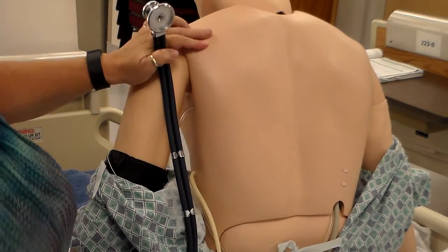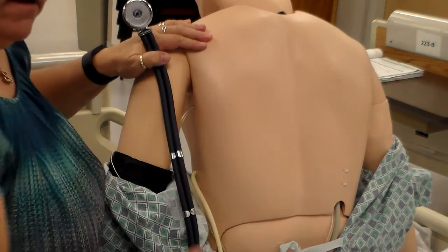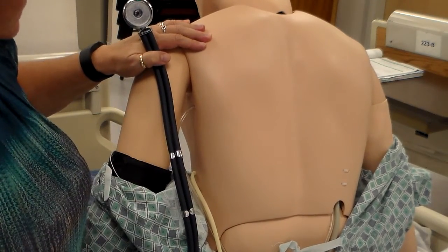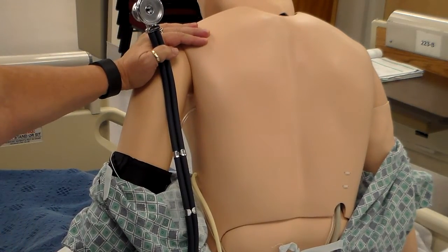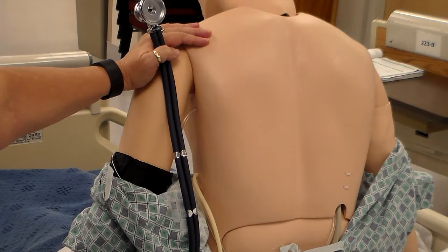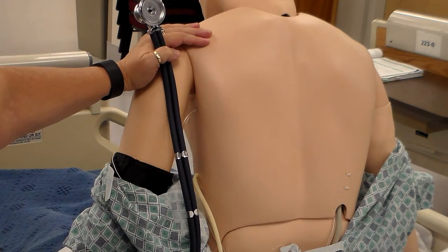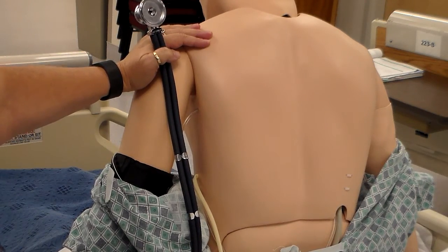All right, guys. So now we're going to auscultate the back of the patient for the lung sounds. You're going to do the same thing. You're going to work in a symmetrical pattern down the back like you did on the front of the chest. You're going to start at the top, work down. You're going to listen to 8 locations, 4 on each side.